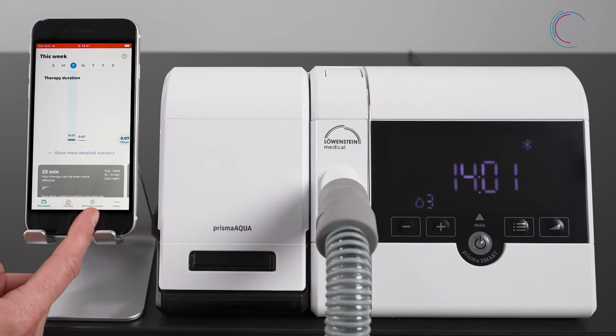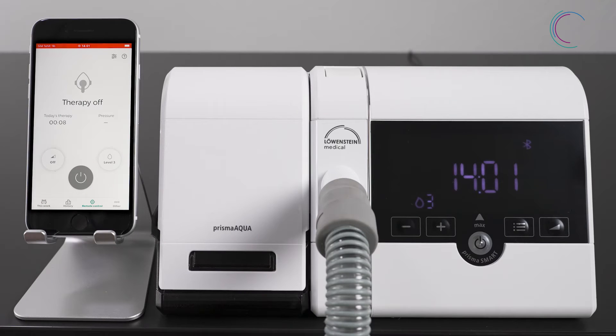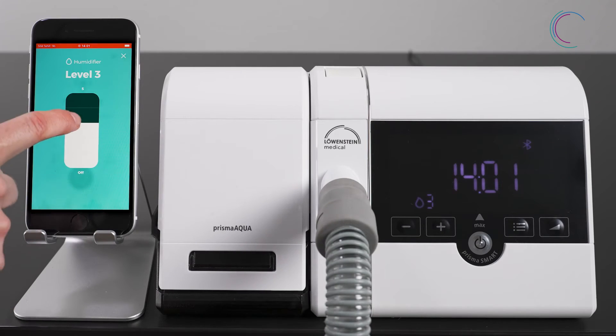Go to remote control and press on the humidifier symbol. There you can adjust the settings of the humidification level.